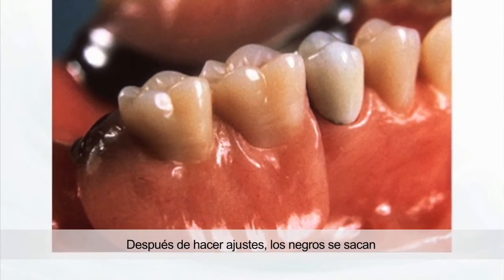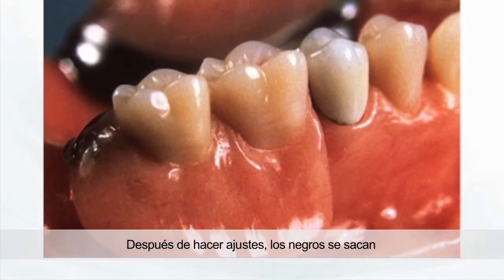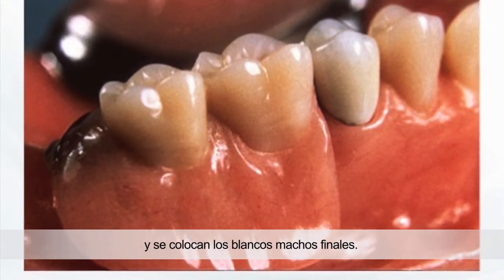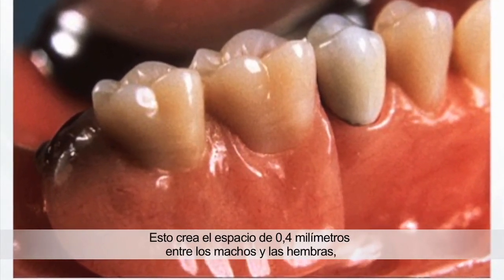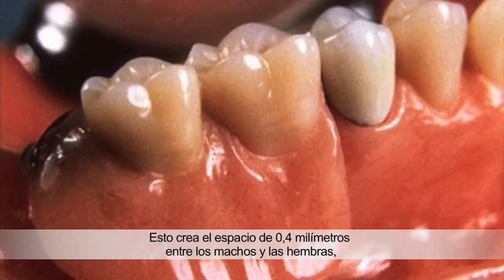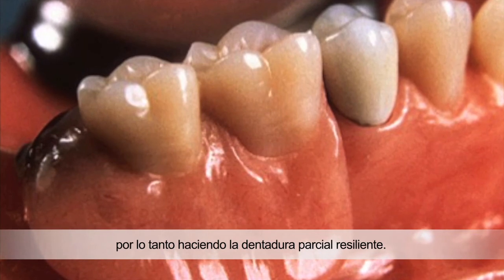After making any adjustments in the mouth, the black males are cored out and replaced with the white final males. This creates the 4/10 millimeter space between the males and the females, therefore making the partial resilient.